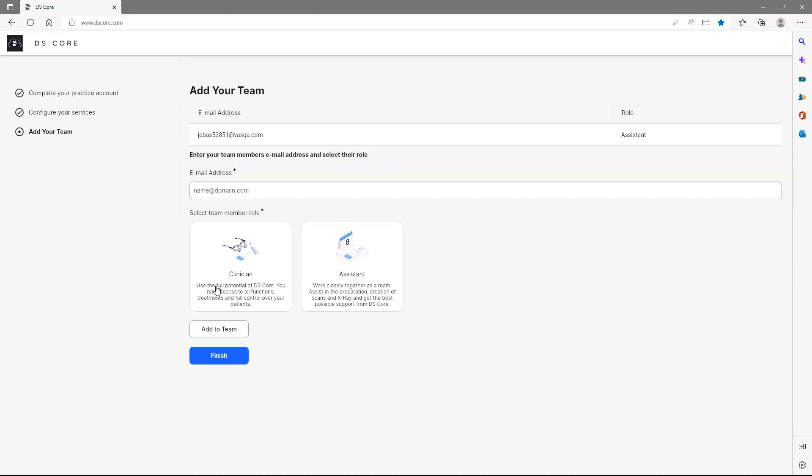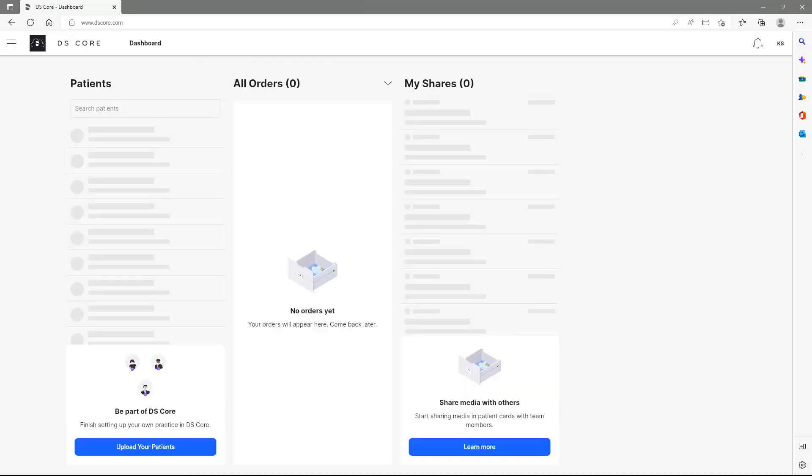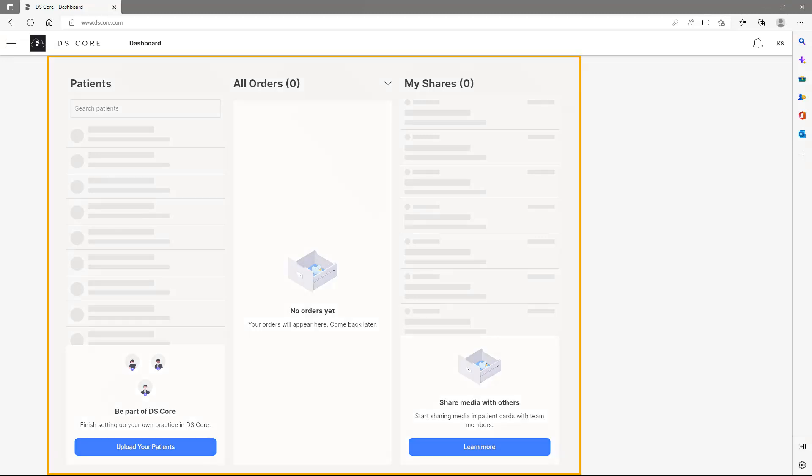Finally, we complete our configuration by tapping Finish. Now, we are on the dashboard of our DSCore account, which is divided into three sections – Patients, All Orders, and My Shares.